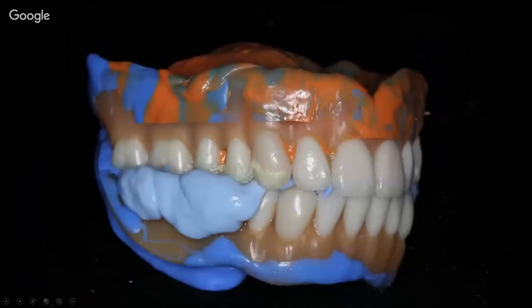And so I'm going to do the exact same thing. If a patient comes to me and they've already got an existing set of dentures, that really makes the whole process much easier, because now those become your impression trays. So a couple of reline impressions inside of that. And then if they're at the right VDO, you just take a bite, and that's your entire record.